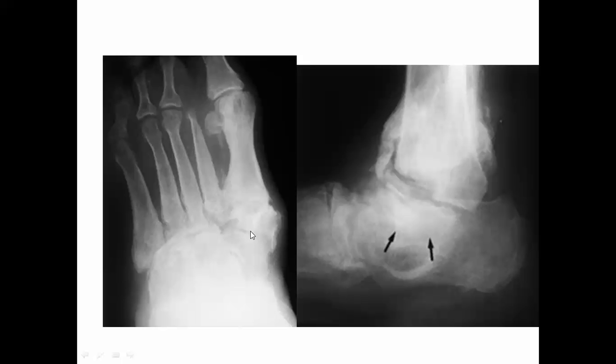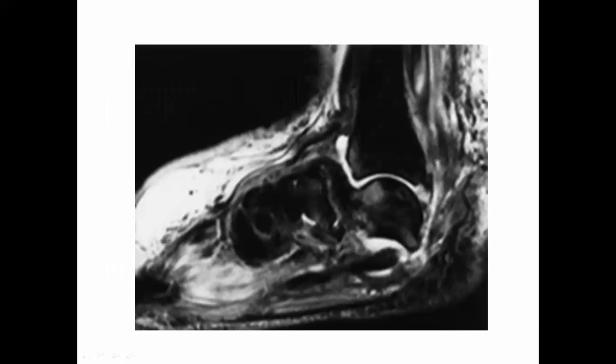Four items to be remembered: 3D and S, density change, disorganization, and destruction, plus soft tissue swelling.